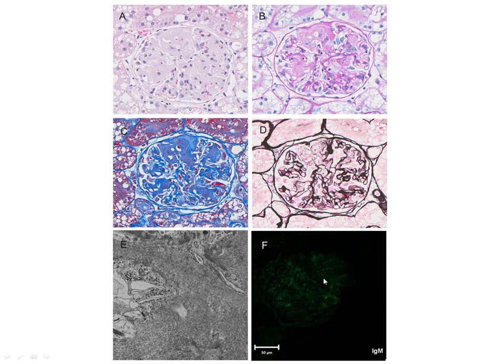It's not PAS negative, but it's not just the nice dark purple like the other places. And again, the trichrome stains the amyloid, but with a little bit of a different tincture.